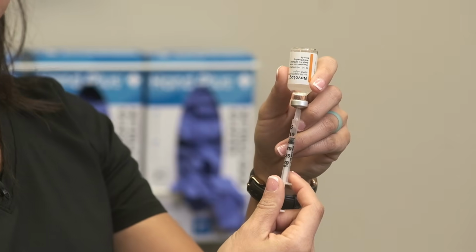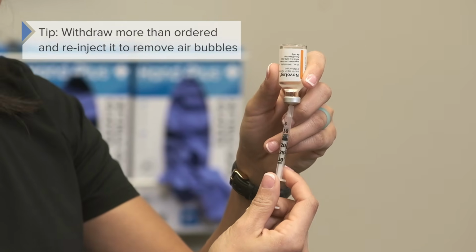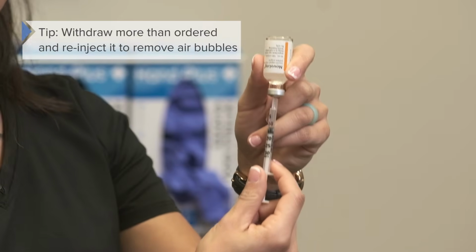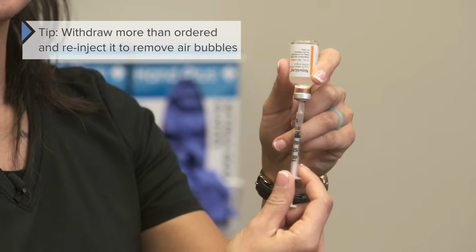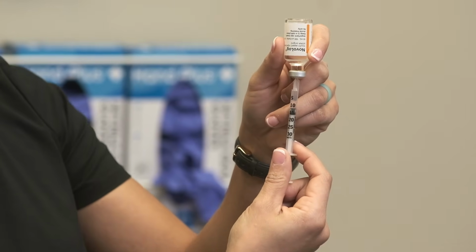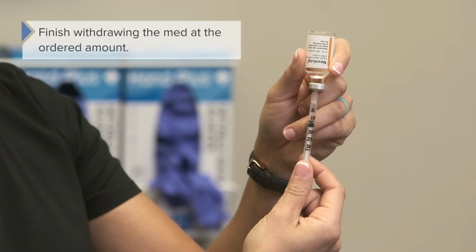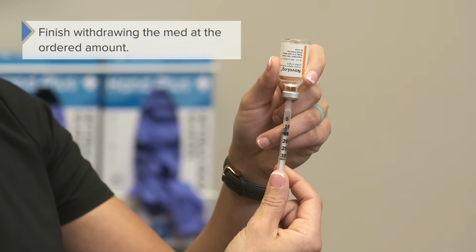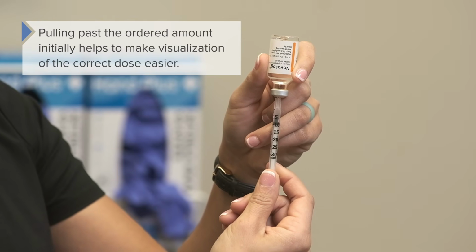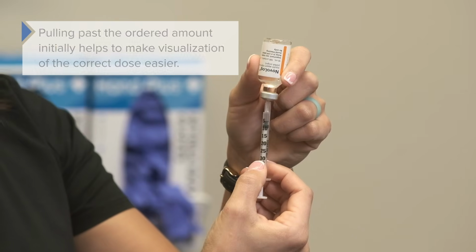This is a great tip for you. What I typically like to tell students when they're learning this skill is if you pull back more medication than you need while you're still in the vial, this will help eliminate air bubbles that you're going to pull up in your syringe. All right, so I've pulled all the way down to at least past the 10, but I only need 5 units here from my medication order. So you will see me slowly push this plunger back up all the way to that 5. So now I have the medicine that I need.